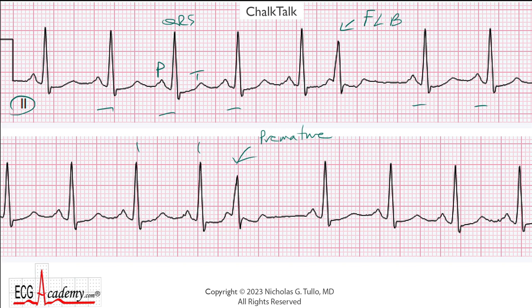You might want to use calipers, but first try to train your eyes to just look at little boxes. Rely a little less heavily on calipers. For example, let's start with this beat right here. Since this QRS lands on a heavy line, it's easy to count off the rate: 300, 150, this would be 100, so it's a little bit less than that — somewhere in the high 90s.